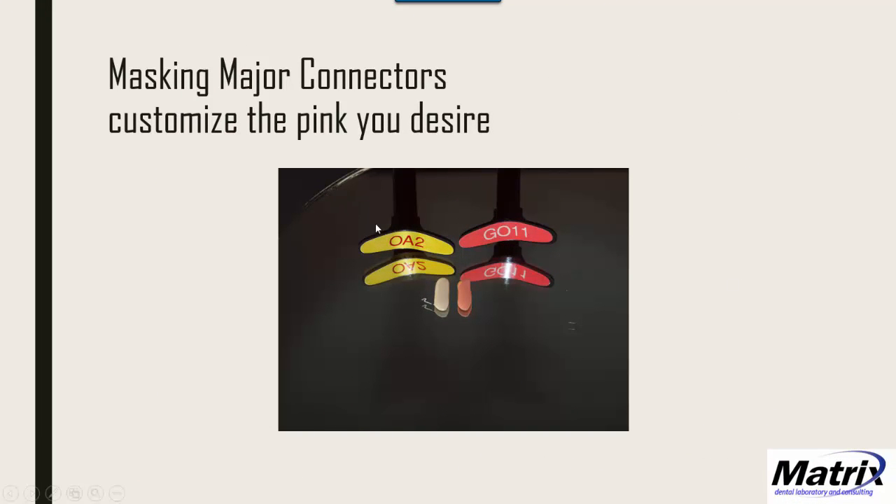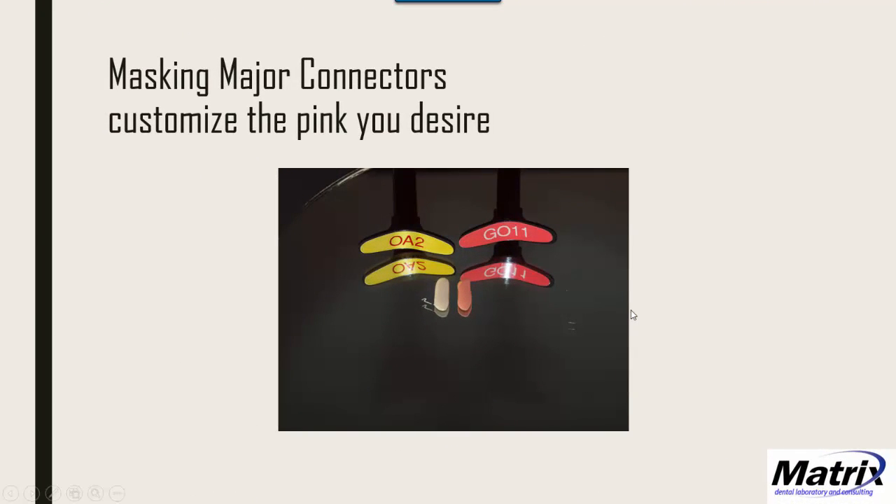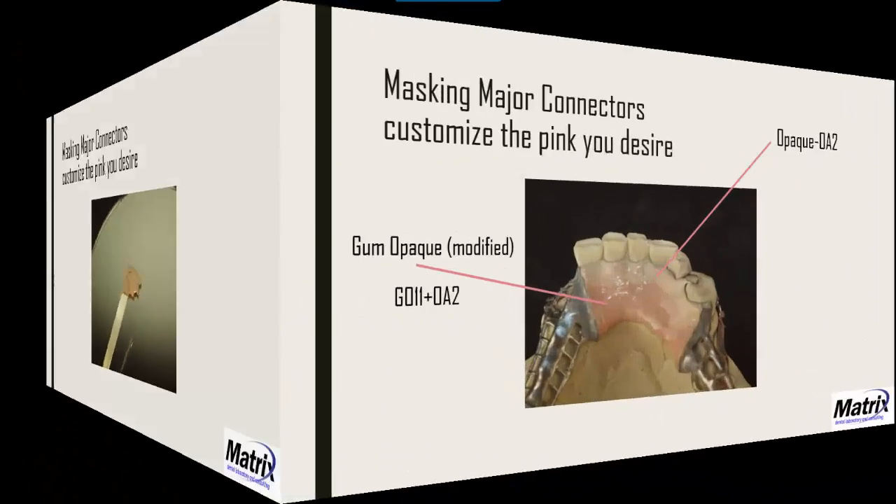The OA2 is the tooth opaque — O for opaque, A2 for the shade. Use OA2 as a baseline because you can always go up in shade value. For a lighter tooth, consider B1 and then use OptiGlaze Color to modify after curing. In this application I'm mixing OA2 plus GO11 together to get a custom pink shade, which I apply to the lingual apron area.